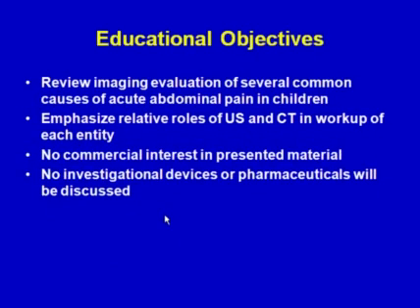In the next half hour or so, I plan to review the imaging evaluation of several common causes of acute abdominal pain in children, with an emphasis on the relative roles of ultrasound and CT in the workup of each entity. I have no commercial interest in the presented material, and I will not discuss investigational devices or pharmaceuticals.